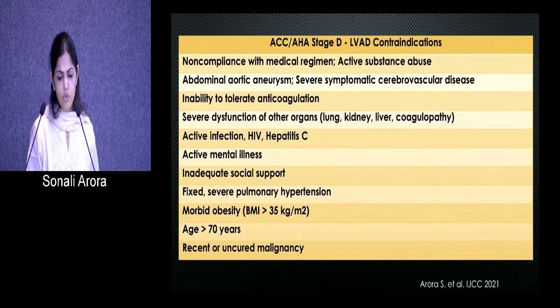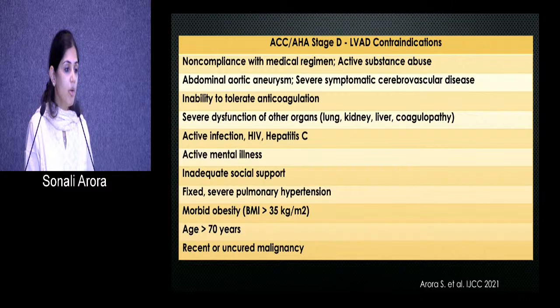So these are a few contraindications and indications for advanced heart failure therapy. Most of them are overlapping. The important one to consider for LVAD as a contraindication will be inability to tolerate anticoagulation. And the other thing would be, if you compare an LVAD population and a transplant population, most of the LVAD patients will have more comorbidities, and most of these patients will be ineligible for transplant for some reason or other, and then we'll start thinking of LVAD.